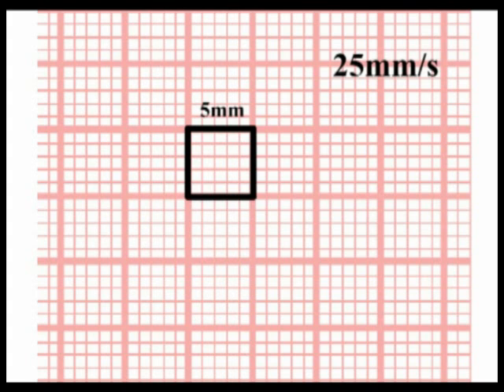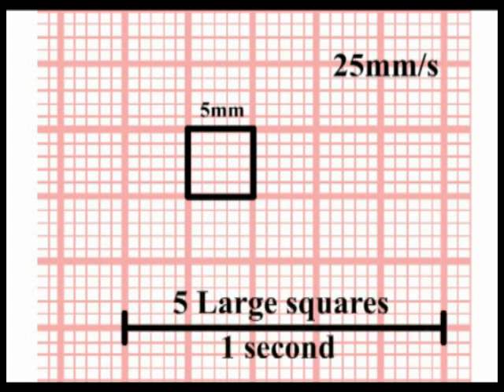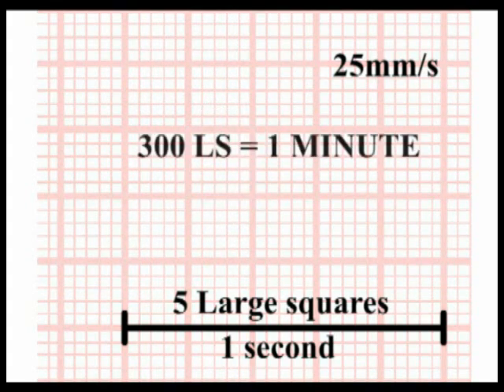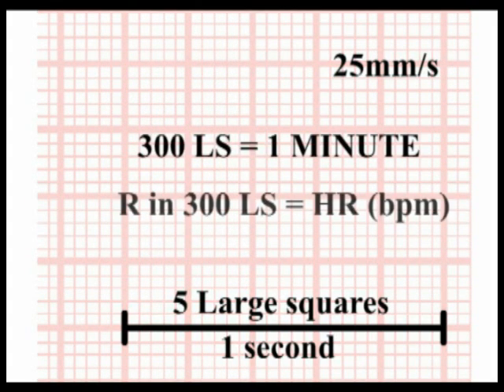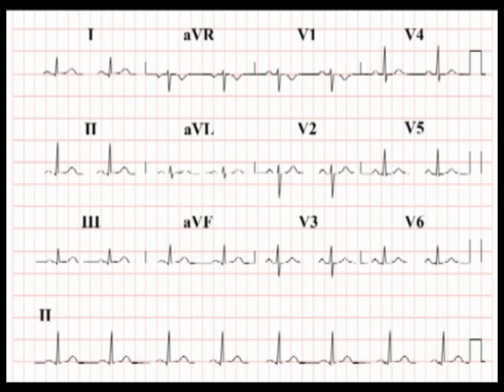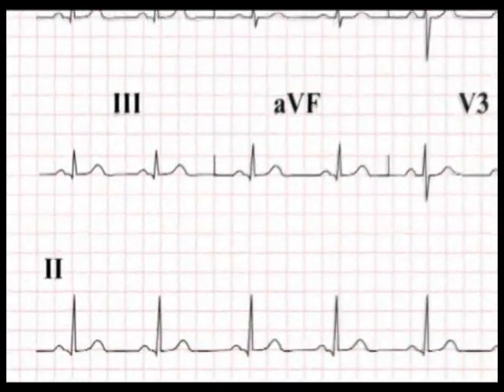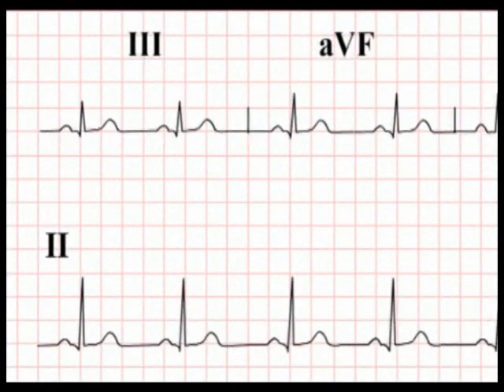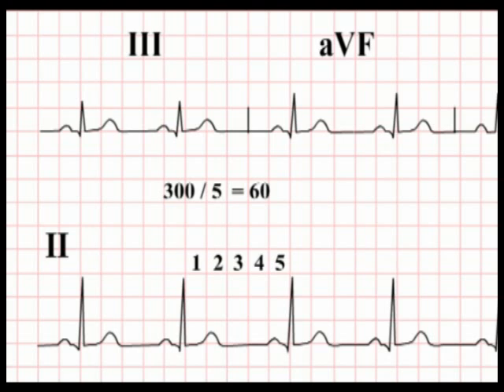At a recording speed of 25 mm per second, 5 large squares are covered in 1 second, so 300 large squares represents 1 minute. Therefore the number of R waves in 300 large squares is the heart rate in beats per minute. Looking at the rhythm strip on this ECG, there is 1 R wave present to every 5 large squares, so in 300 large squares there will be 60 R waves — a heart rate of 60 beats per minute.